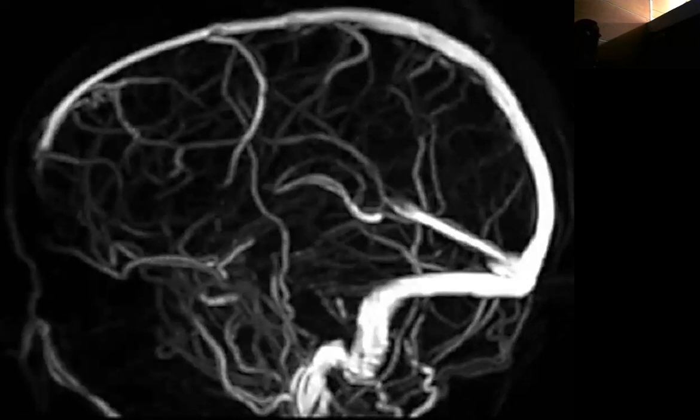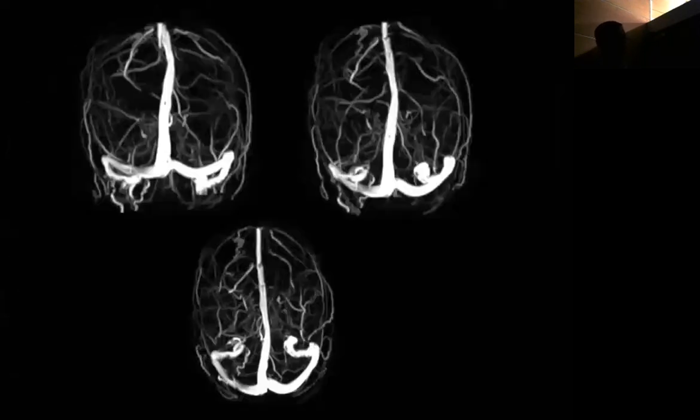Again, we ask residents in the general ward, what is this? They have no idea. And he's supposed to be a neurosurgeon, Dr. Junaid, and practice in neurosurgery. They have no idea. Nobody has put MRV in front of them and told them what these vessels are. They would not know that this is transverse sinus, this is sigmoid sinus, jugular bulb, jugular. They have no idea. The tumor is there, and you can see the deviated vessels.